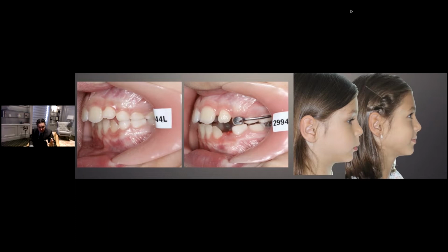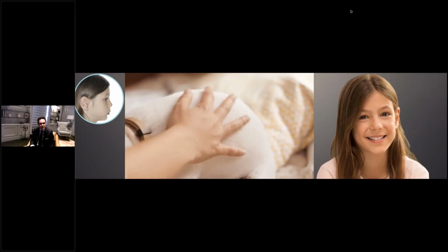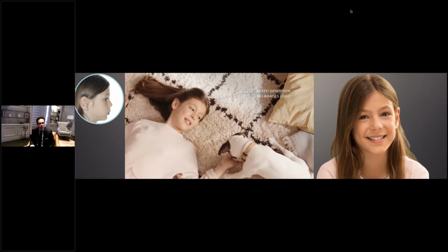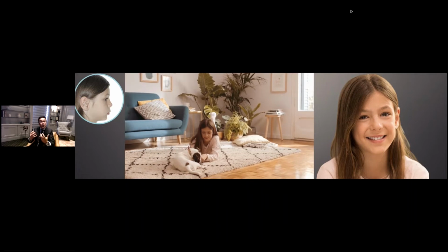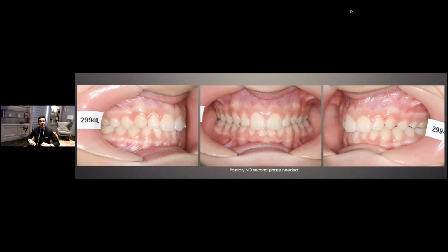So we go from stage 1 to the overcorrection, but here we can see that the patient has a completely different scenario of the position of the mouth. This functional position that we established, and we invite this mandible to position properly, is going to help us very much in accomplishing a good mandibular position. And the question comes, here we have a patient. I like sometimes to place movies of patients in which we are able to see the beauty of the position of this mandible, the natural, the patient in motion, the patient in action, in which we can see how the patient looks. But here is the evolution of this case.